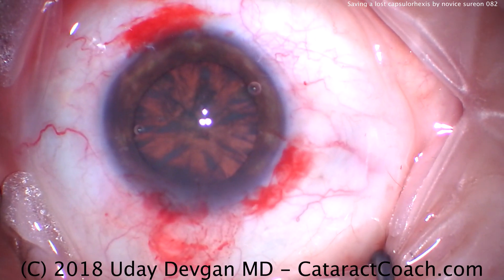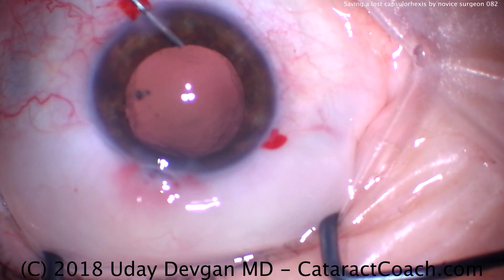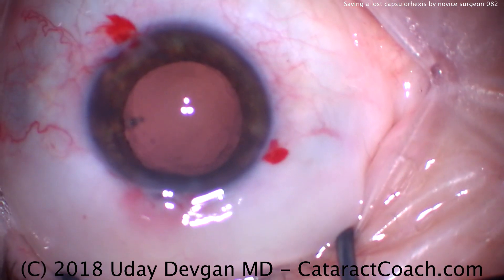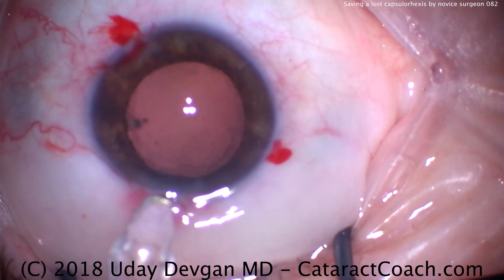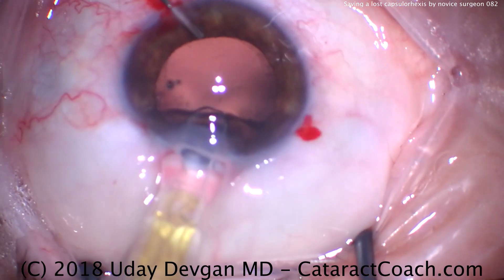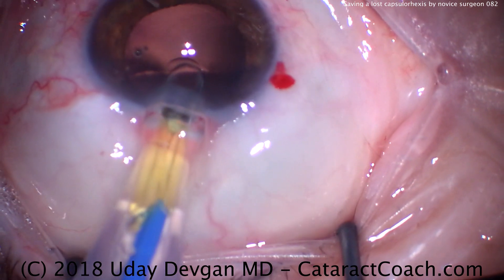Taking our time, we're going to bring this around and create a nice round capsulorhexis, encompassing the irregular area. We finish the rexis. Fast forwarding towards the end of the case — filling the bag with viscoelastic, the IOL on the eye, and now you can see the rexis looks pretty darn good. It's a little on the large side, but it's nice and round, curvilinear, and continuous. No steep or sharp edges, no areas for it to radialize. It looks pretty good.